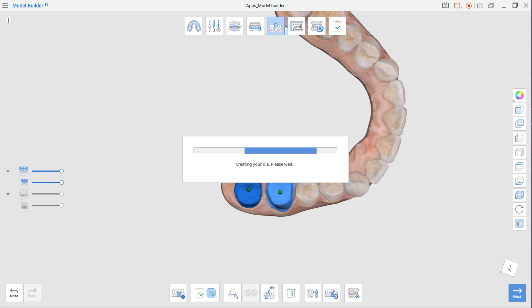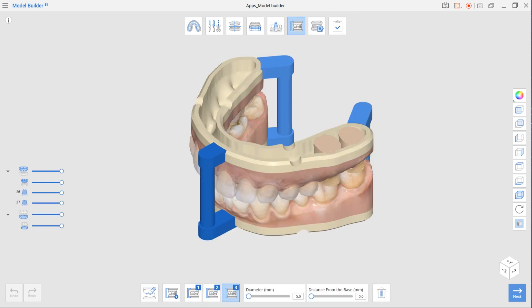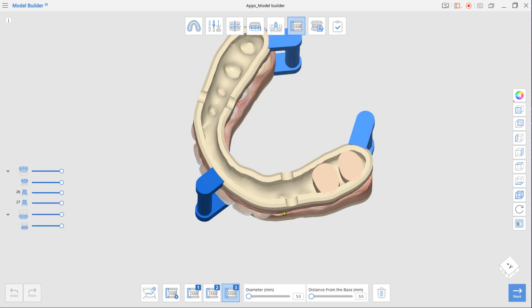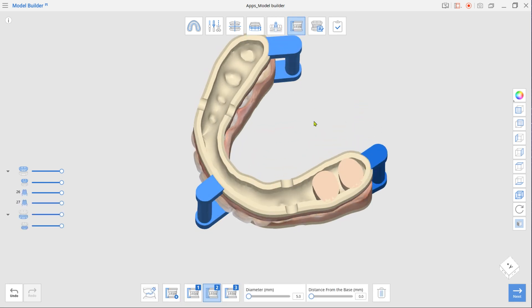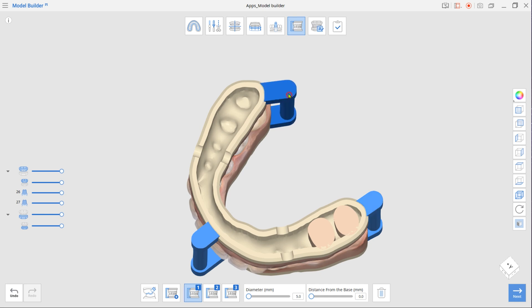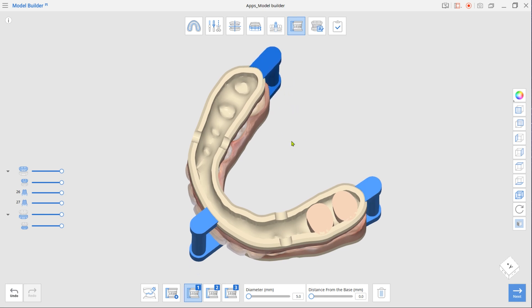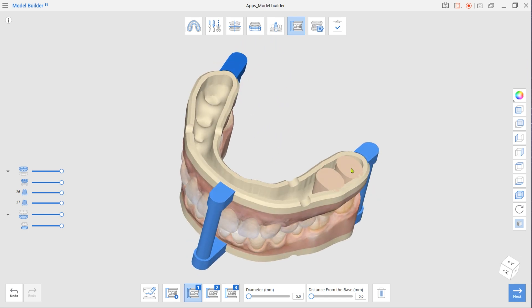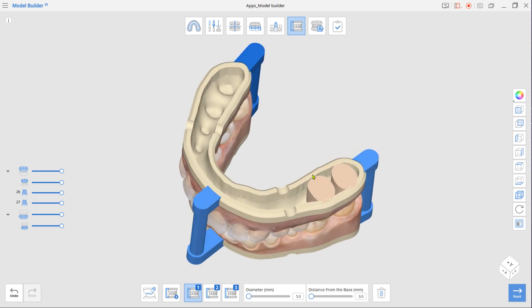Next step is Articulator mode. The program will automatically attach three articulators. Use the Diameter slider to change their thickness. Click and drag each articulator to adjust its placement.